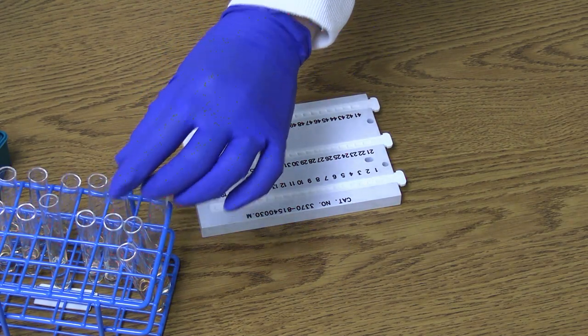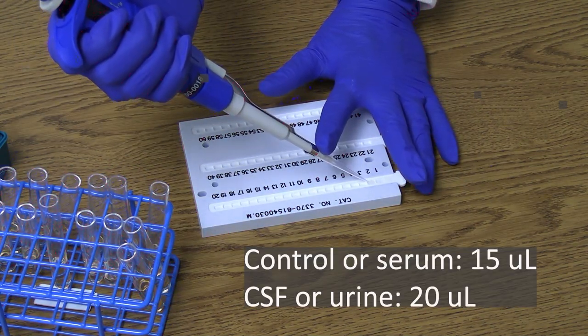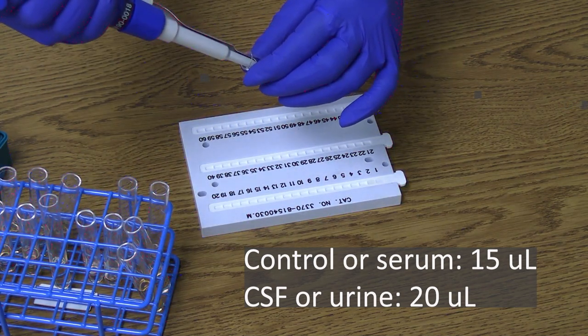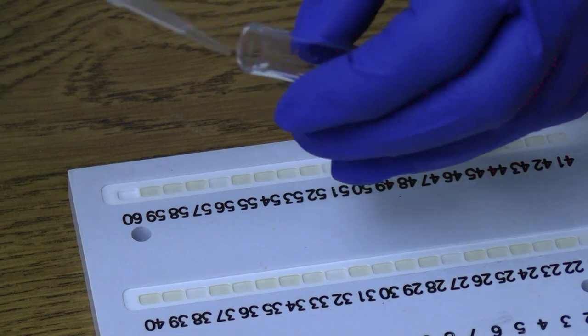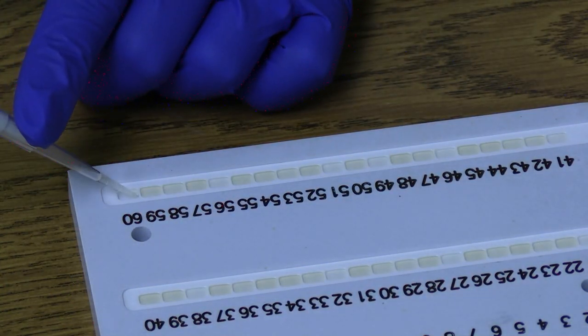Pipette the following volumes of samples per well. Control or serum, 15 microliters per well. Urine or CSF, 20 microliters per well. While pipetting the specimen, ensure to distribute the sample evenly by spreading it across the four corners of the well.